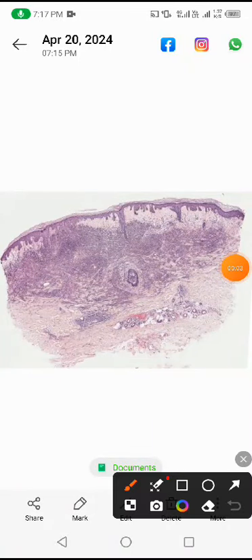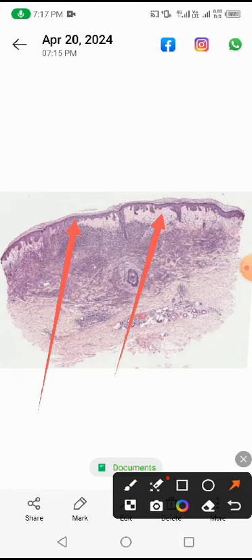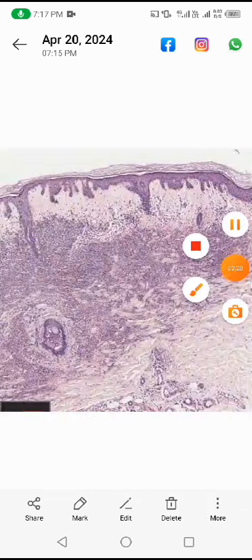Assalamu alaikum. This is a histological picture of Sweet syndrome. A scanning view shows the epidermis and dermis. The epidermis looks normal, but the papillary dermis is loose and pale, with papillary dermal edema. In the lower dermis, there is a dense inflammatory infiltrate.